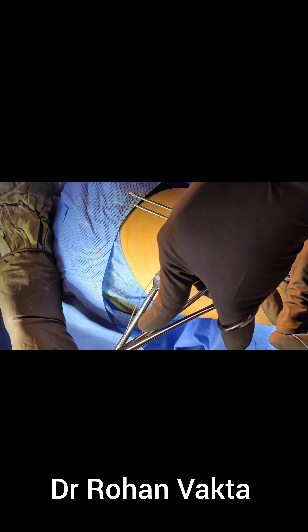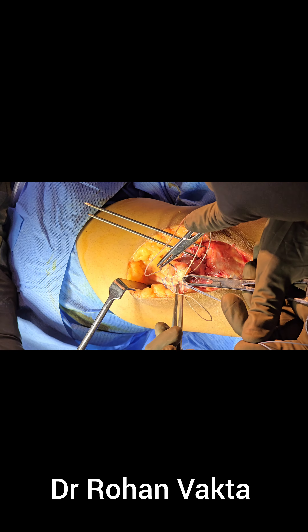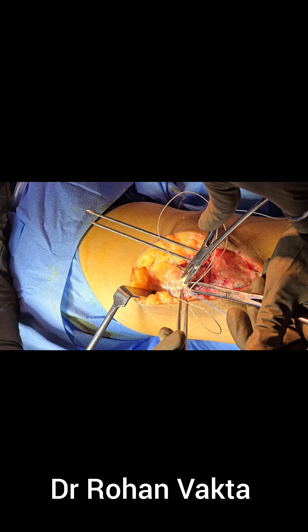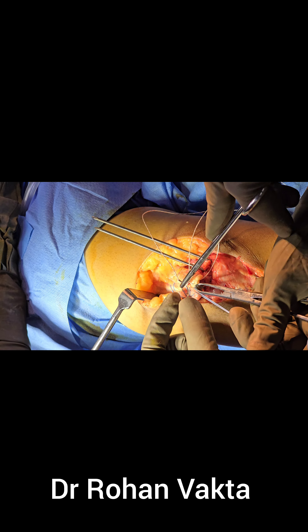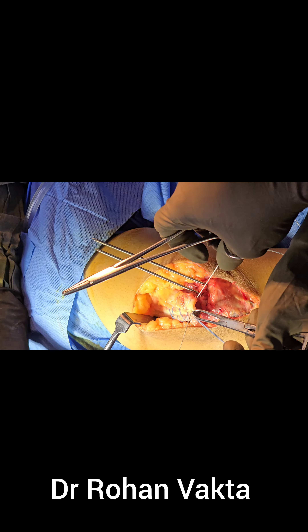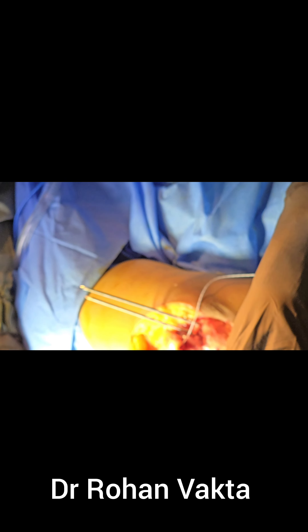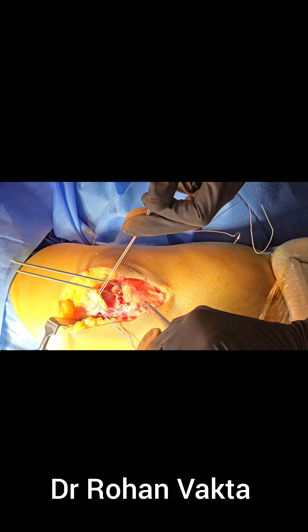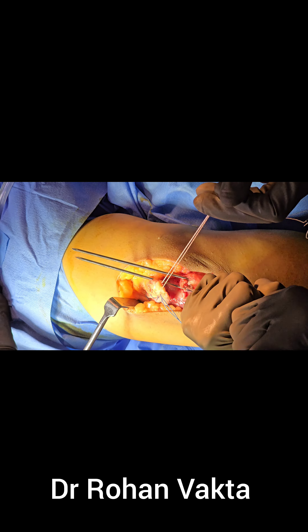Number two FiberWire is taken — one blue color and one TigerWire — and both fiber wires are passed through the triceps tendon in a Krackow fashion, from middle to lateral and the second one from lateral to medial. Both fiber wires will have a total of four strands distally, and these strands will be used to do transosseous repair through the olecranon process.